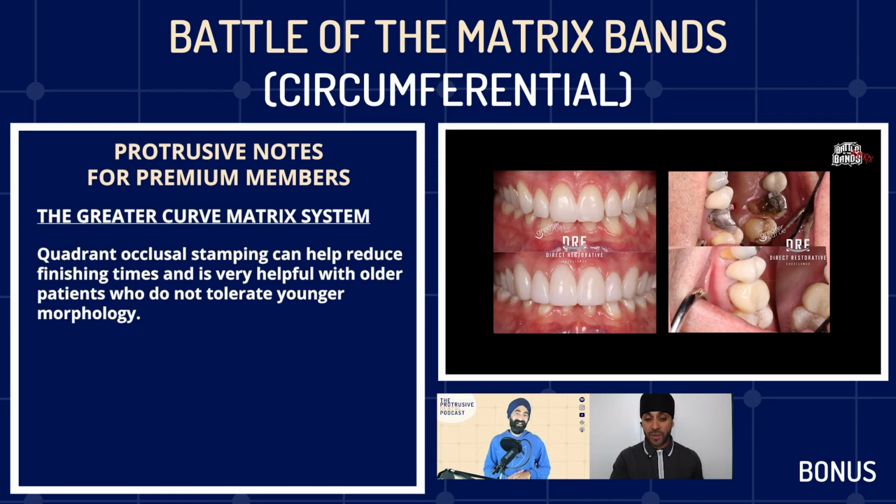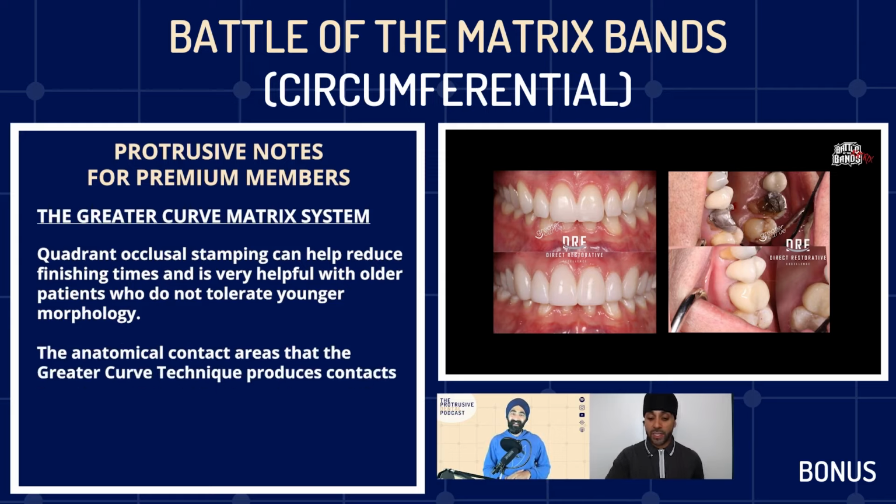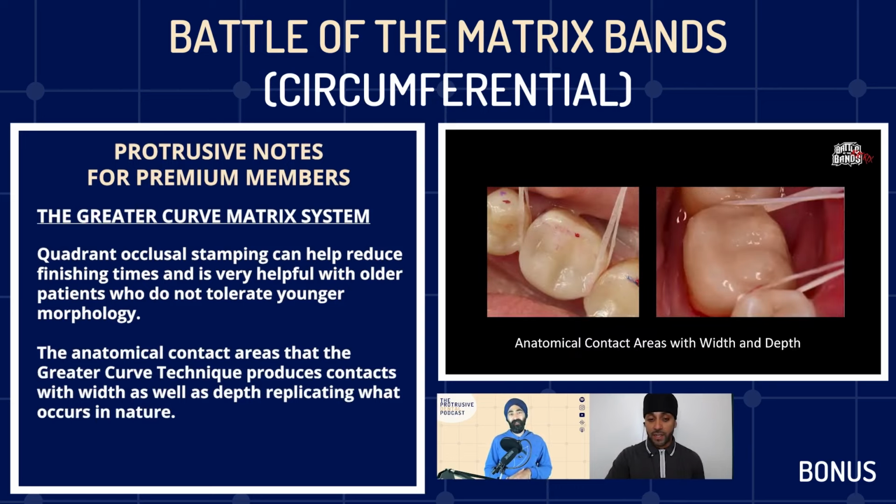And just touch on this as well. These are the anatomical contact areas produced by the greater curve technique. So those contact areas have width as well as depth, right? That's actually what we see in nature, and we're just replicating that as well.